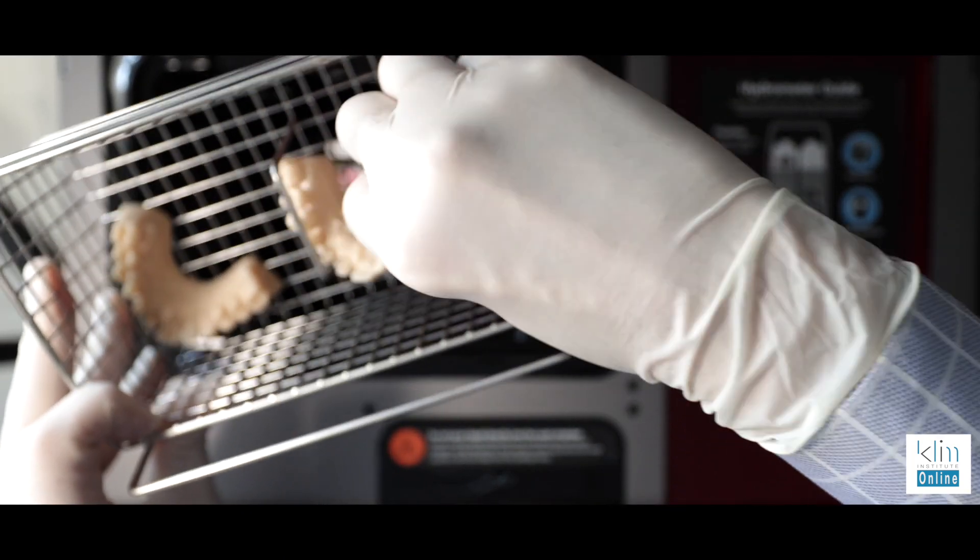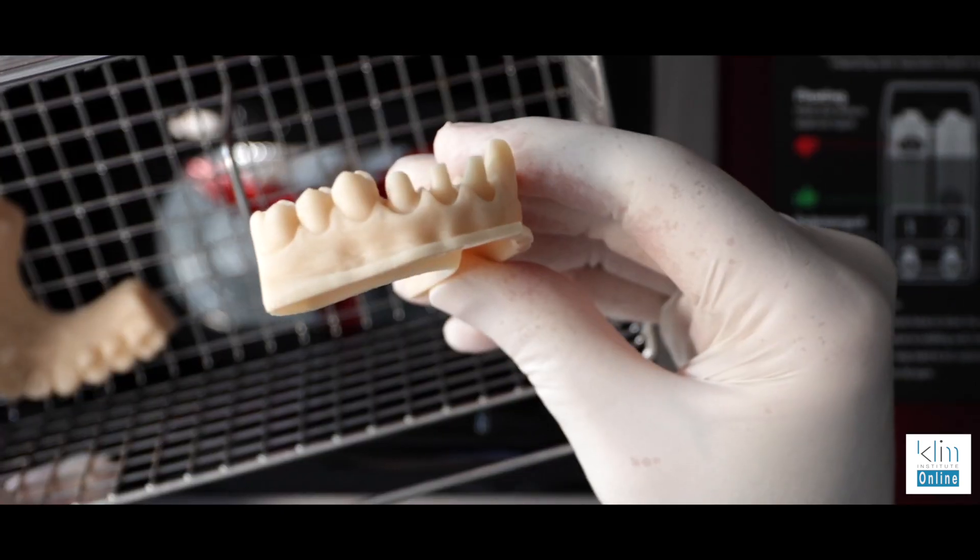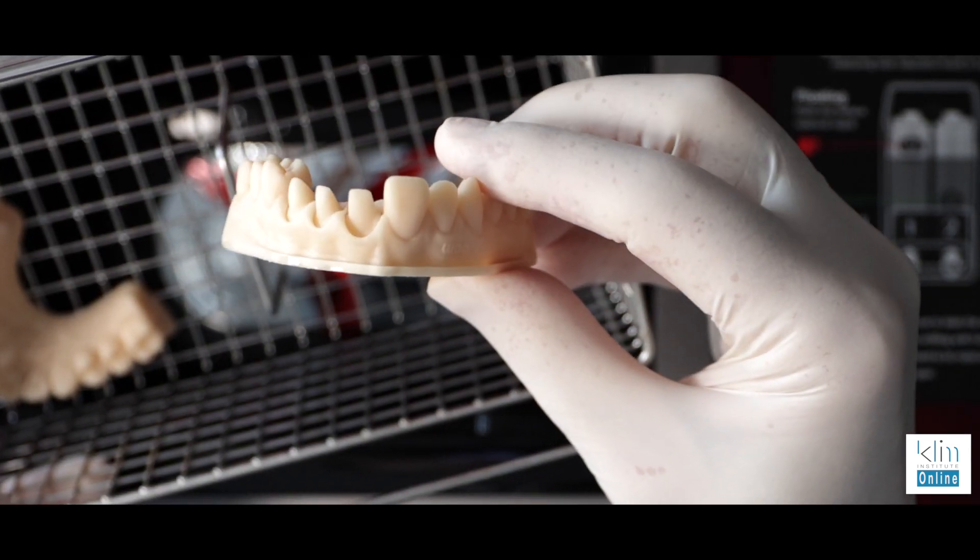With the SprintRay Pro Wash & Dry, it does it all for you. It gives you a better wash and better quality. It's all automated and it works so well.